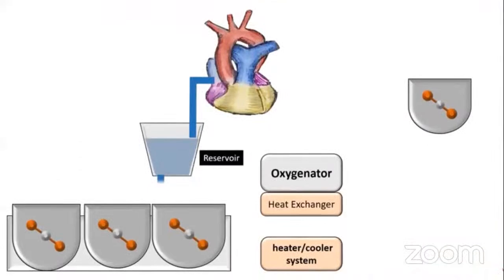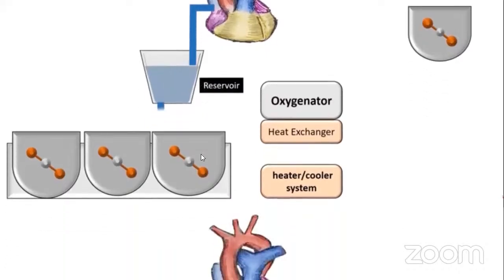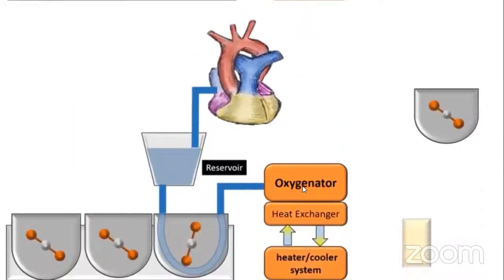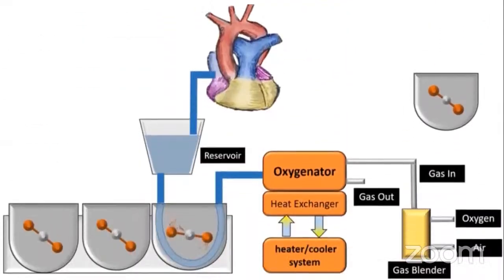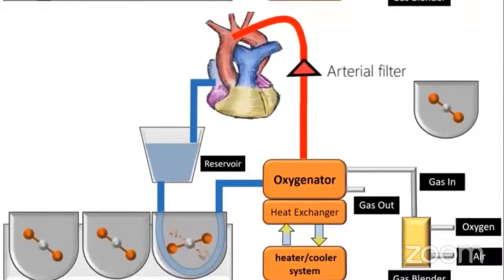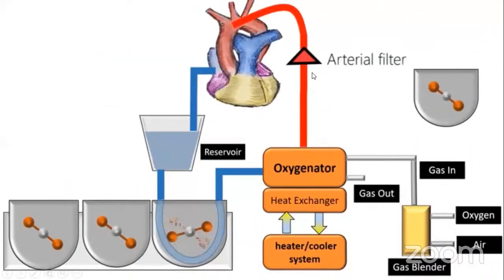This diagram basically simplifies the components and mechanism of cardiopulmonary bypass. We have the venous cannula, draining blood from the venous system of the body into a venous reservoir. Then the blood goes into the oxygenator and heat exchanger. Gas exchange occurs and temperature changes, with either cooling or heating of the blood. After that, it goes through an arterial cannula to the systemic circulation.